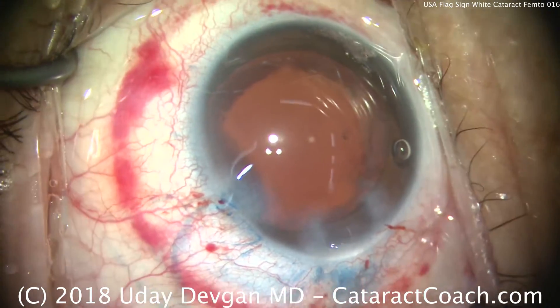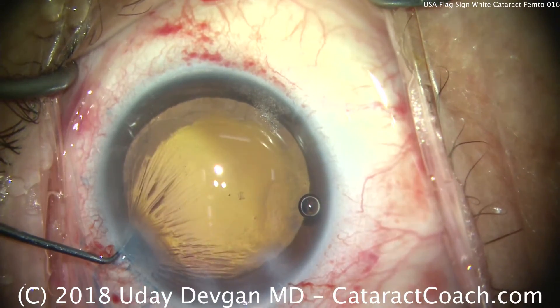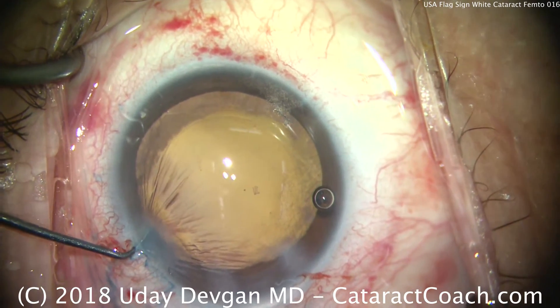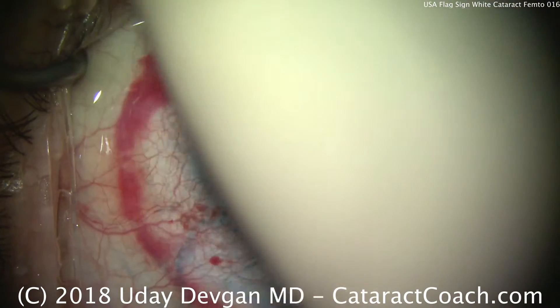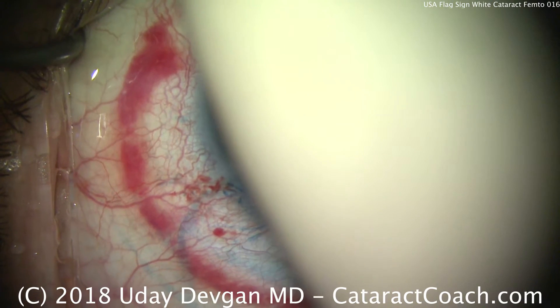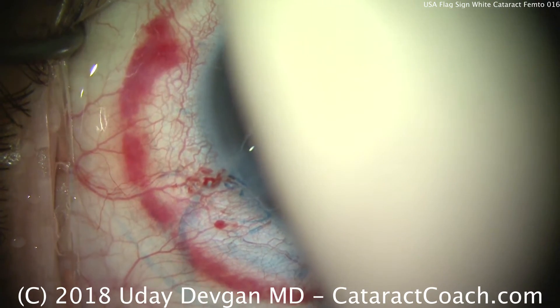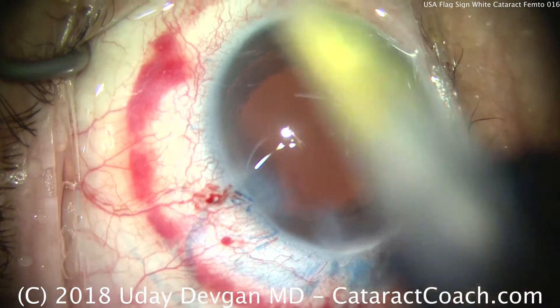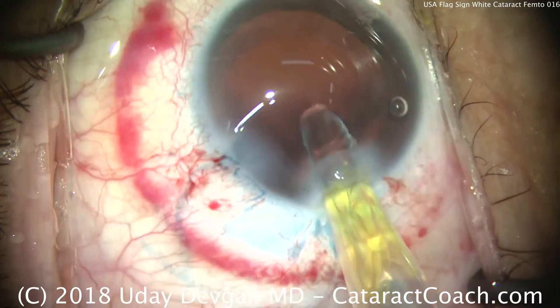It's okay to give these patients a little bit more steroid during that time. Using the chopper to fixate the eye if the patient is having a hard time looking at our lighting. Blocking the light while the technician loads our lens — usually there's no delay, but if there is, we can be very patient. This is still a pretty quick case. There's the lens from the technician — insert that into the eye and deliver it.